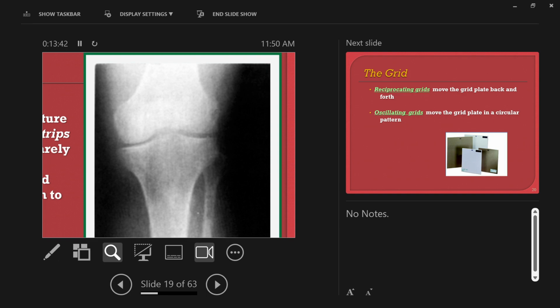This has a thickness, that has a thickness, every part of the body has an associated depth or thickness to it. That's not shown on the radiograph. You can't see that dimension, right? But the X-rays had to get through that dimension to get to the image receptor. Thickness matters, and as a part gets thicker, it will scatter more X-rays because the X-ray beam is interacting with more tissue because of that increase in thickness.